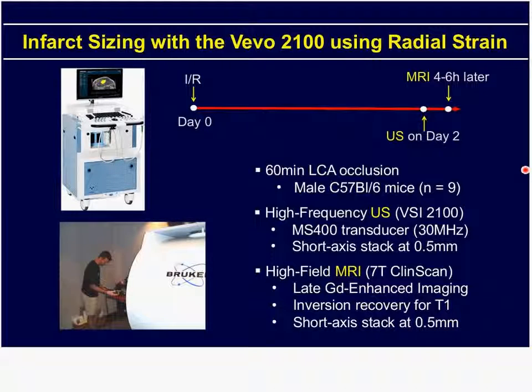be done better on a parasternal long axis B mode or parasternal short axis M mode? This participant is finding this variation. I wonder if you have any experience, Dr. French, with these two types of measurements. So we rarely use the M mode because we prefer to be able to assemble a 3D reconstruction of the heart.